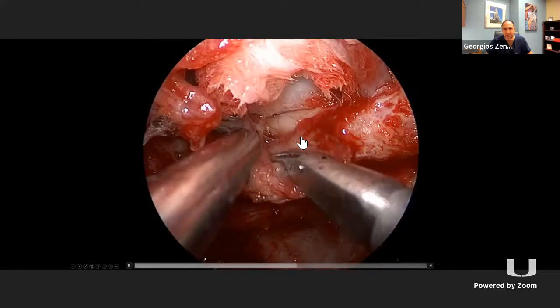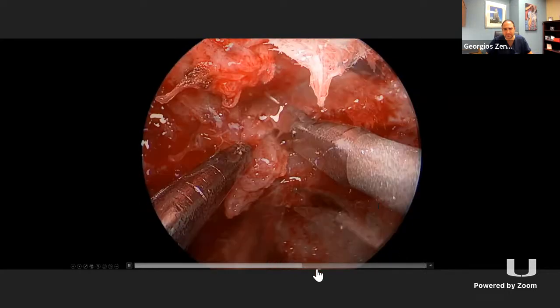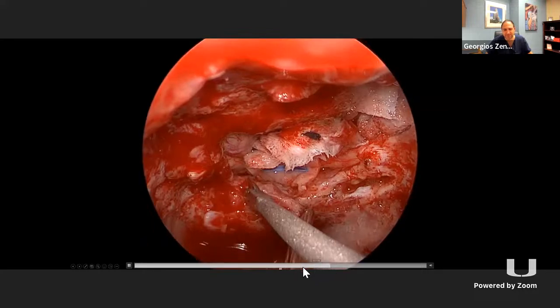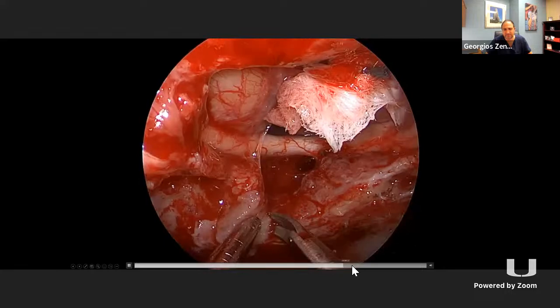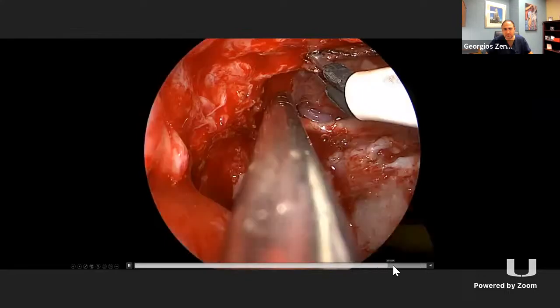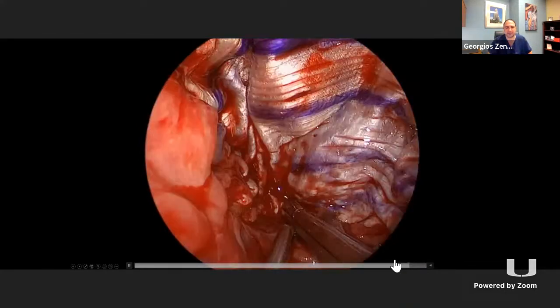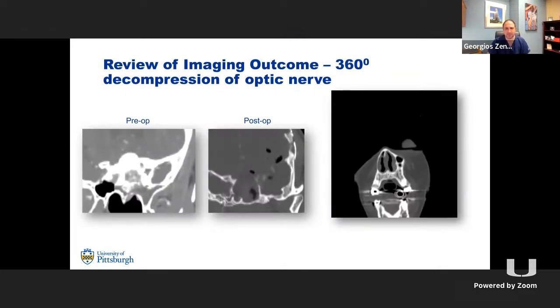Here's the ophthalmic artery coming into view. So trimming the distal dural ring up to the ophthalmic and the diaphragma sellae. So this is essentially a diaphragmatic meningioma that's secondarily calcified. You want to think about it like that. This is the final result. Still no Simpson grade 1 resection, but it's as good as we could do. And we were able to improve her vision.